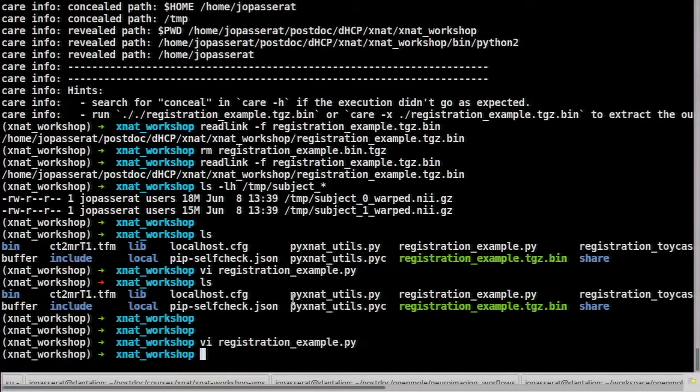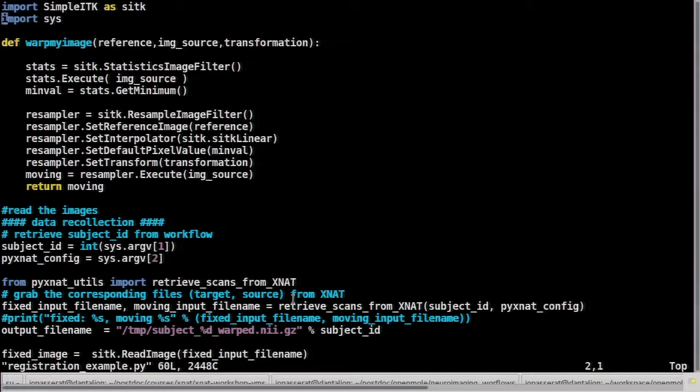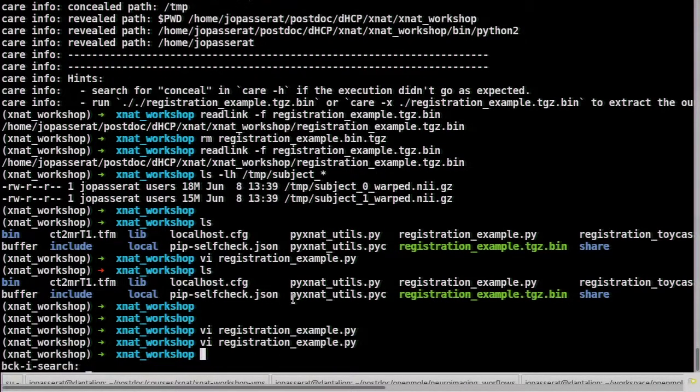So hopefully this works. But as you can see at the beginning of the file, I'm using a couple of things to make this work. I'm using SimpleITK, I'm using XNAT. So this is already two Python packages, plus potentially all their own dependencies. So if I want to take this application and execute it elsewhere than on my laptop, well, I will have to somehow package all these things. How do I do that?